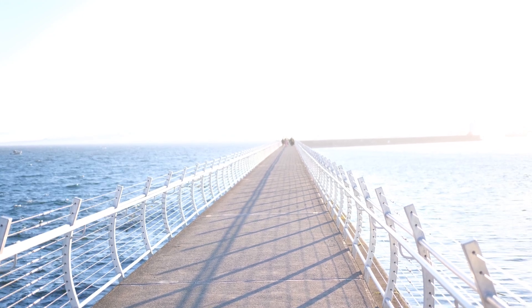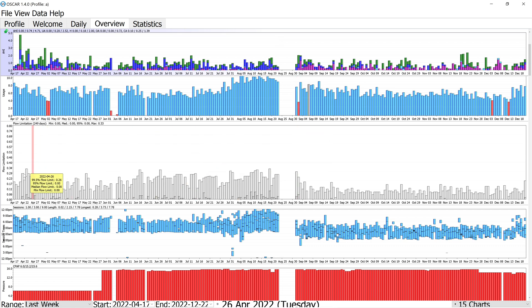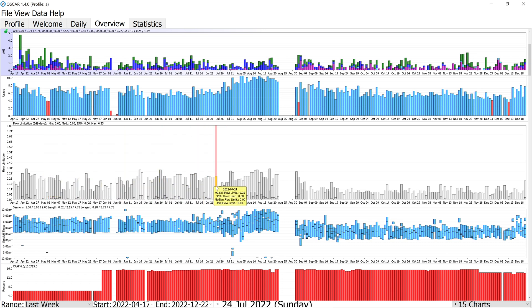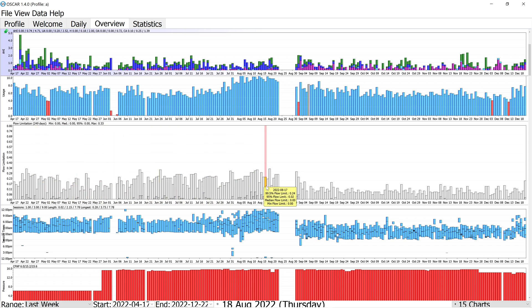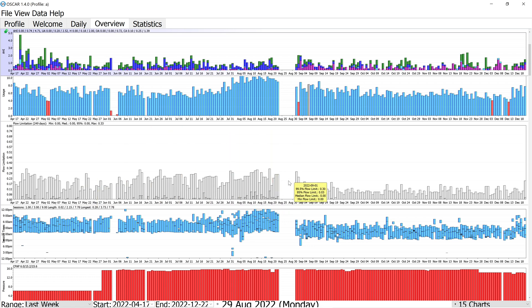Just like everyone has a different threshold of arousal, everyone is also likely to have a slightly different degree of reaction to any given change. The first thing I want you to see in this chart is all of these days of flow limitation. Each bar is one day, and we're pretty zoomed out here — from April 17th all the way to December. You can see that the flow limitation on average is much higher on this side than over here. These bars are much shorter on average than all the bars on the other side of this gap. So what happened?